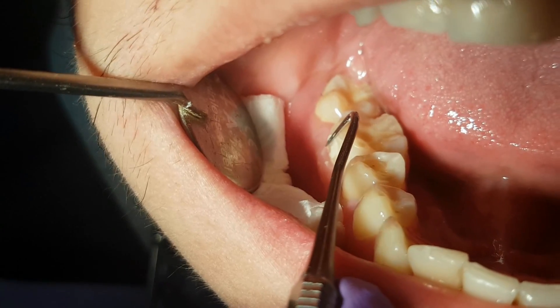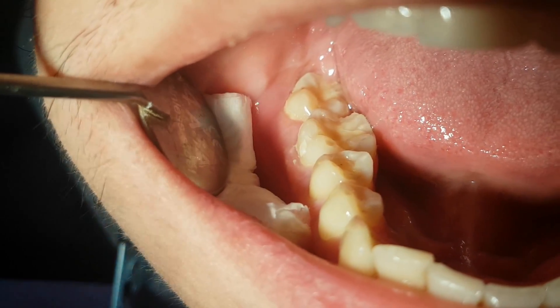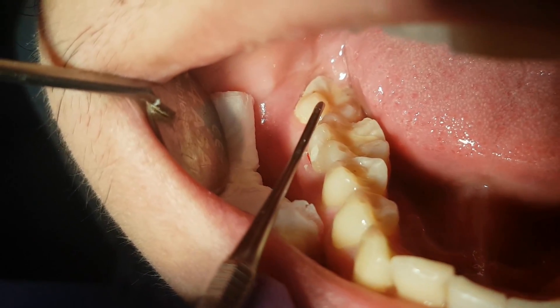Using a dental explorer, we remove any excess filling material we don't need and make sure that the border between the filling and the tooth structure is unnoticeable.